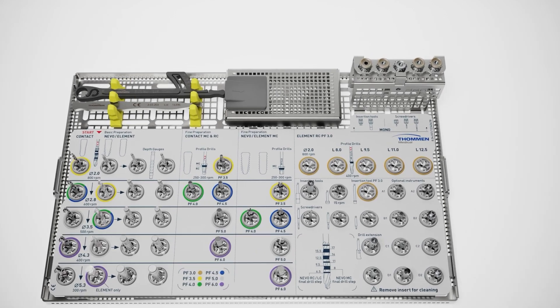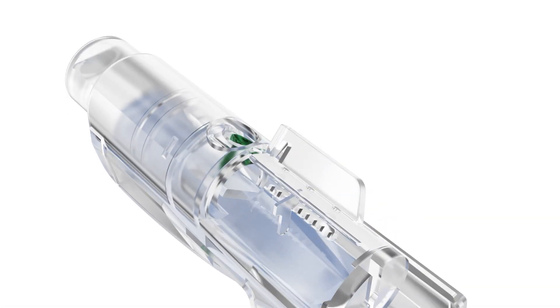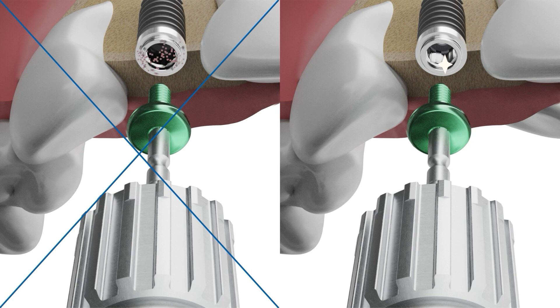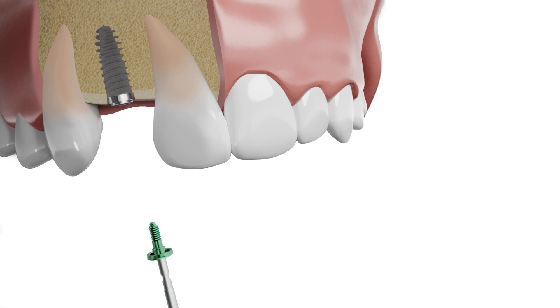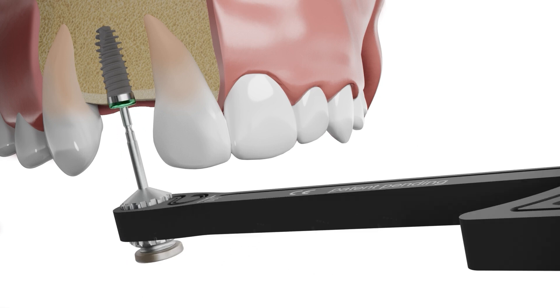If you wish to insert the healing cap, twist the cover of the Appikit container and engage the healing cap with a mono screwdriver. Ensure that the interior of the implant is clean and free of blood to enable proper closure. Screw in the healing cap by hand until it is in slight contact with the implant shoulder, then use the mono torque ratchet with a maximum torque of 10 Newton centimeters for final tightening.